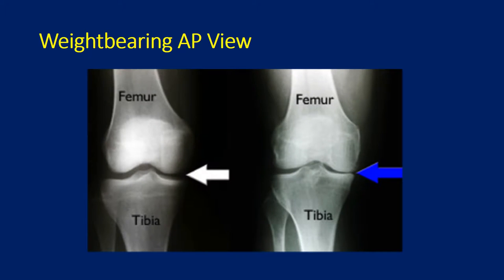Perhaps the most important view is the weight-bearing AP view. This is a view where the patient is standing while an x-ray is taken. You can see here on the left the knee with the white arrow shows an adequate joint space of the medial compartment as well as the lateral compartment. The same x-ray taken with the patient standing up on the right shows that the space narrows, and thus the diagnosis of osteoarthritis, nearly bone-on-bone, would not have been detected in a non-weight-bearing view.